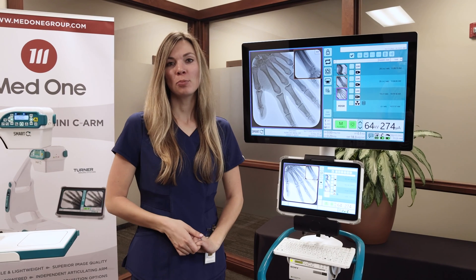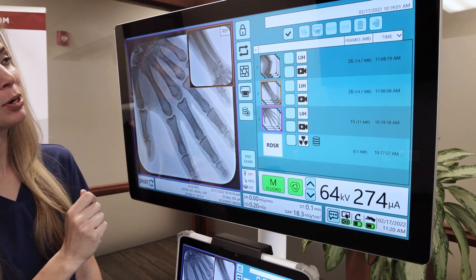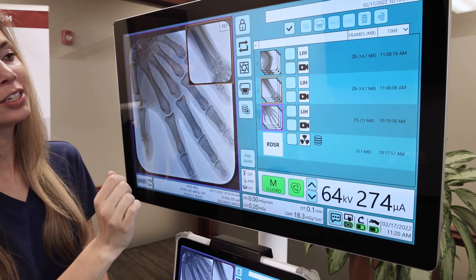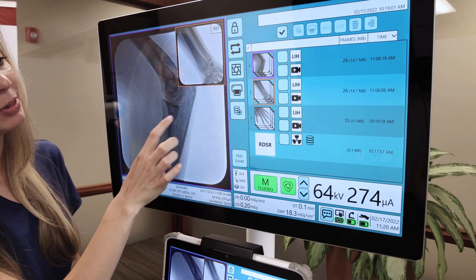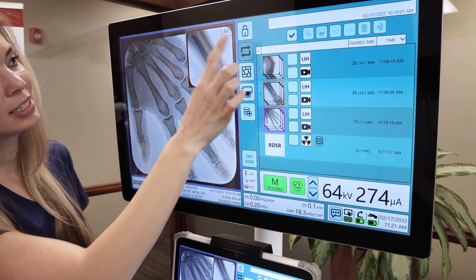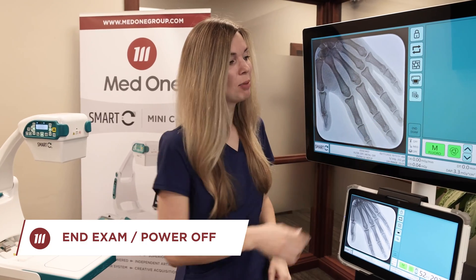We've taken a few more images to show you another function of the image library. Your main window is in the purple box and your reference window is outlined in orange. To change those images, simply double tap or drag and drop them to the desired location. If you would like to switch these images, press the button here. When your exam is complete, press the end exam button on the monitor.